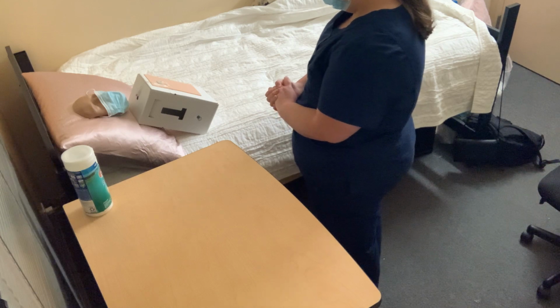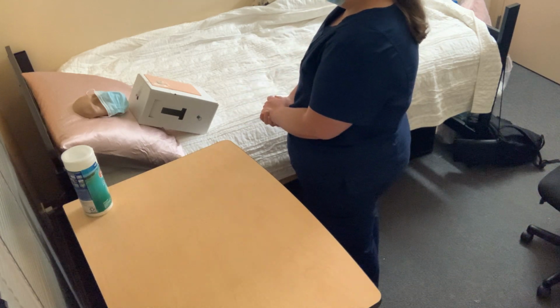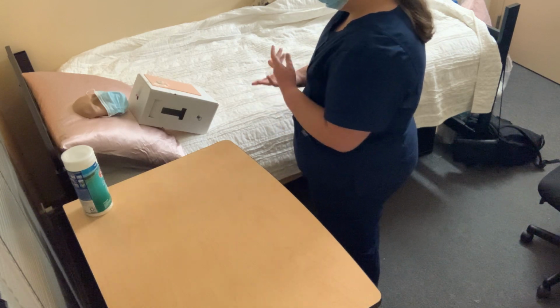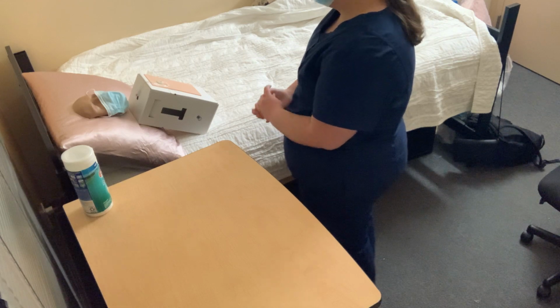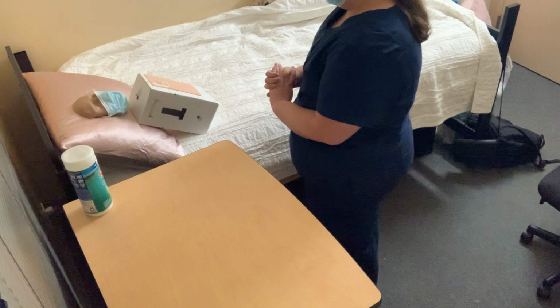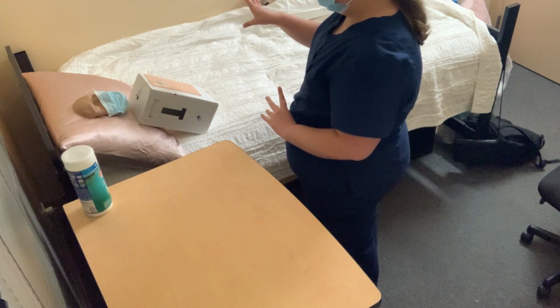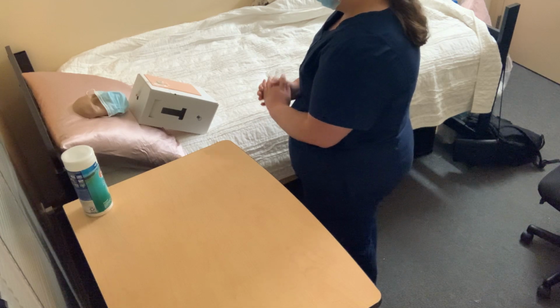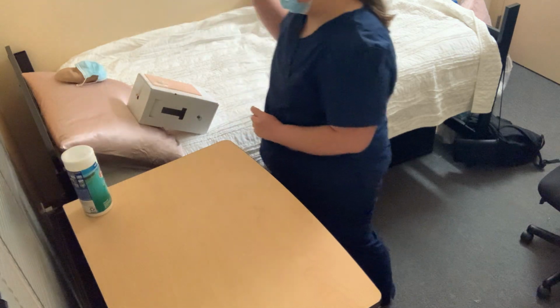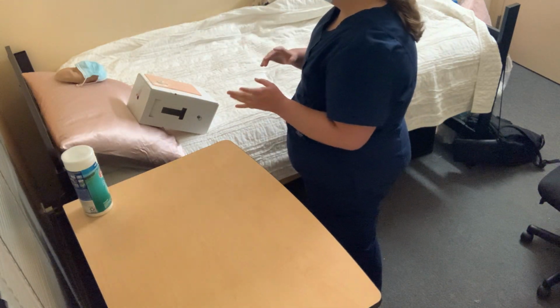First, I just want to make sure you are in the optimal position for me to do the dressing change. I see you're already sitting upright, so that position will work for me. Are you comfortable here? You are? Okay, perfect. The second position change I need to do is I'm going to ask that you face the left side of the room towards the wall. So if you could just turn your head now. All right, thank you, Mr. Smith. I will let you know once you can turn your head facing forward again.